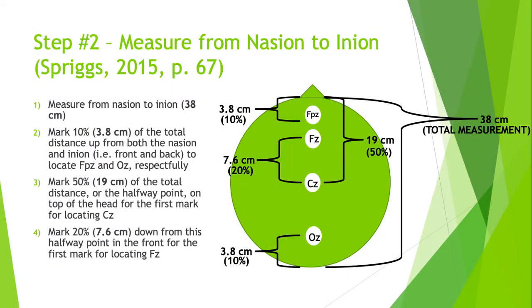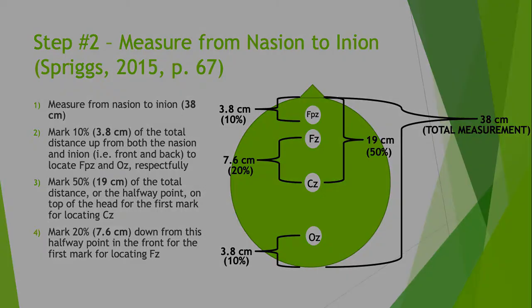So to serve as a brief review, the second step is to measure from the nasion to Inion and make subsequent markings as indicated in the previous video. The measurements used in the video are shown as an example in parentheses and bolded.